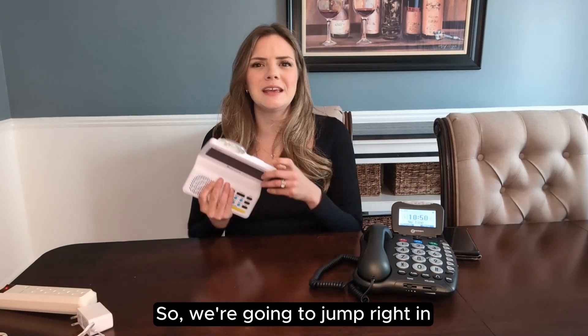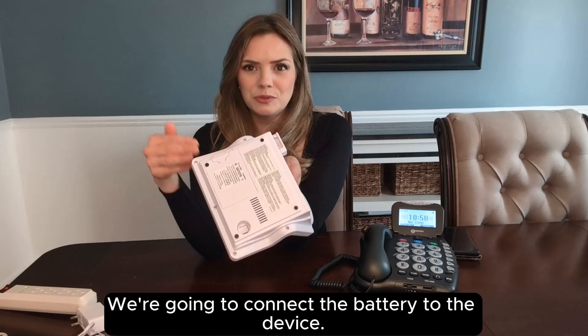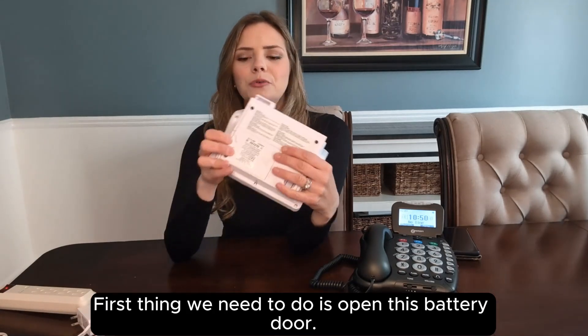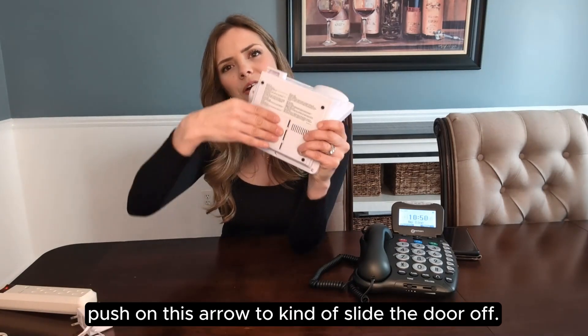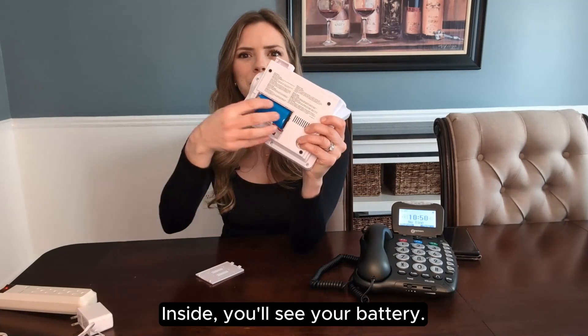We're going to jump right in by starting with the battery. We're going to connect the battery to the device. The first thing we need to do is open this battery door. Put your finger under this lever here and push on this arrow to slide the door off. Inside you'll see your battery.